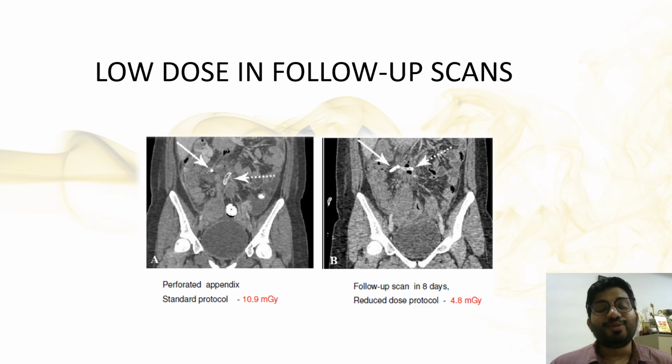Further techniques to reduce the radiation dose involve low dose in follow-up scans. As I mentioned in the previous session, there will be continuous exposure for a particular patient who has been admitted in the inpatient department. Many patients are admitted, so those patients will come multiple times for a CT investigation. So avoid unnecessary exposure to the patient.